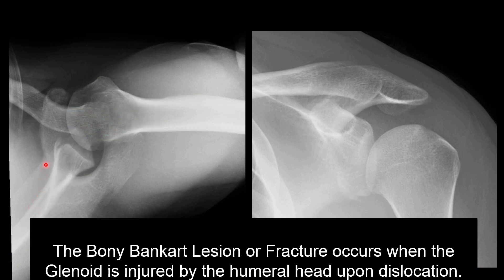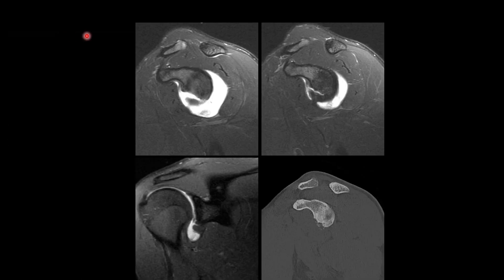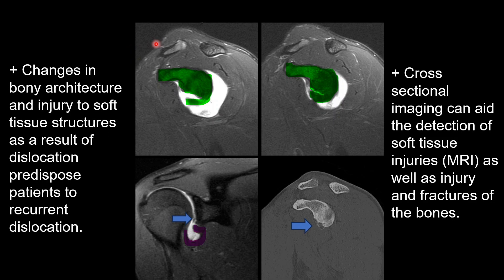In the same images without the overlay, we can see again this disruption of the anterior glenoid, as well as this disruption of the bony cortex. Here are some cross-sectional images of the shoulder to help demonstrate some of the things we've discussed in this video. Up top, we have two sagittal oblique views of the shoulder on T2-weighted MRI. On the bottom left, we have a coronal view of the shoulder on T2-weighted MRI, and in the bottom right, we have a sagittal oblique view of the shoulder on CT scan. Here's our clavicle, here's our acromion, and here's the glenoid, showing this large bony Bankart lesion on this image here, as well as this one.